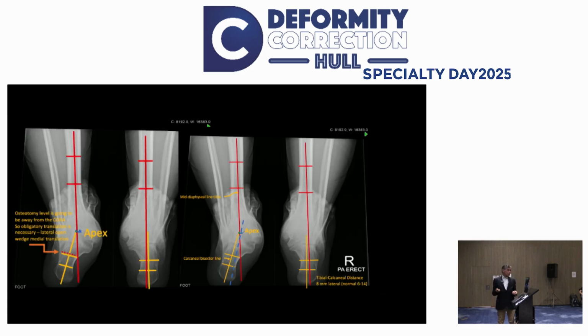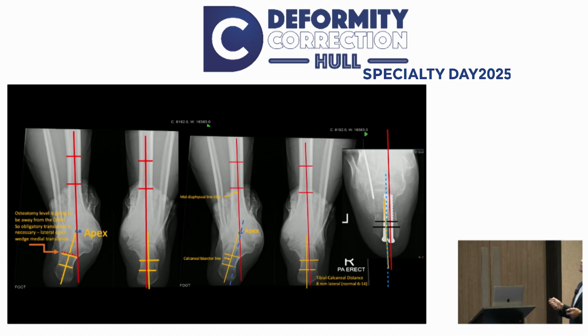So we go back to our rules. So this is Cora here, tibial axis in red, in yellow here, and they're meeting somewhere superior to the subtalar joint. And we can only do this correction by doing a calcaneal osteotomy. So it's rule number 2, okay? And what you need to control is how you displace this, because we want to get this relation. Remember those numbers, within 1 or 2 millimeters of that. So I did a calcaneal osteotomy, shifted it, and you have to do a calcaneal axial view while you're doing this procedure. And that's the end result, I think within 1 or 2 millimeters of that.